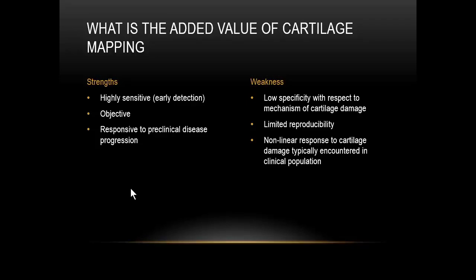An advantage is that they're objective. They give us numbers that we can obtain back. We can then systematically look at ways to reduce variation in those types of measurements. We can look for ways to reduce systematic variation between manufacturers. It allows us to pool data from large populations. So for large clinical trials, it's very useful to have that objective information.